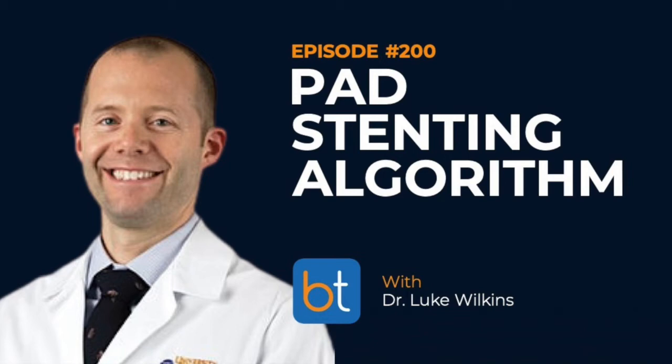But yeah, if we get through and we verify that we're in true lumen on the other side, that's when I'll consider doing atherectomy within this CTO. So that's why I do think there is benefit in staying true lumen, especially when the lesion is less than 10 centimeters, because I feel that you can get a lot of benefit from doing atherectomy and PTA in those patients. If you're able to stay true lumen and it is longer than 10 centimeters, I still think it might be beneficial to do atherectomy. Again, I think there's some increased risk associated with it, but depending on the atherectomy device, you may be able to achieve a significant lumen gain without the negative of placing a stent.